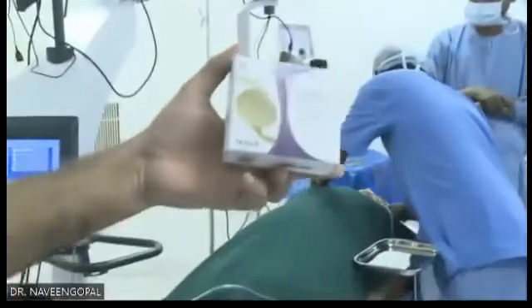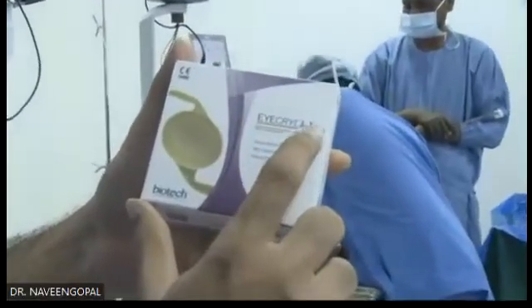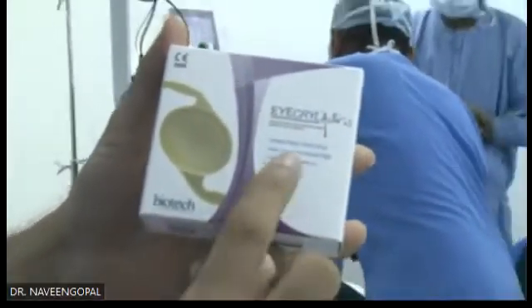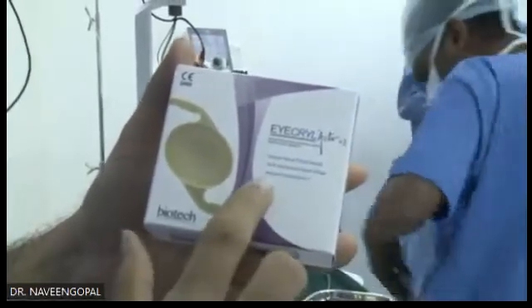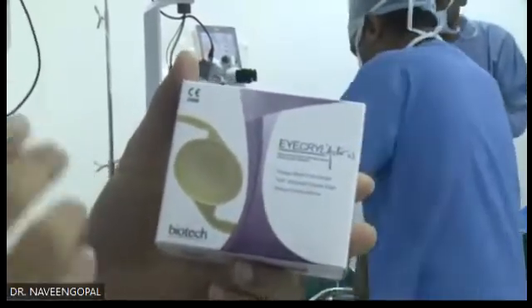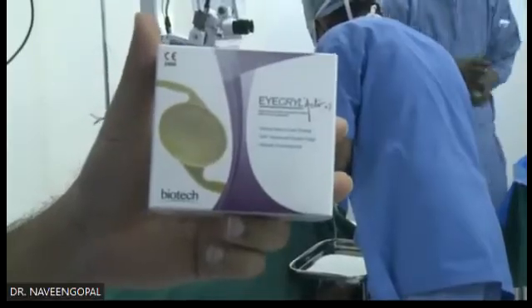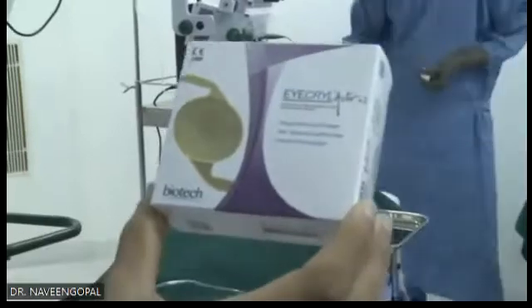So this is the lens Activa, which has a near add of +3. It is a wafer design, 360-degree advanced square edge, with a natural chromophore. It is not that yellow when you compare with the IQ lens or Panoptics. It is a slightly tinted yellow chromophore.